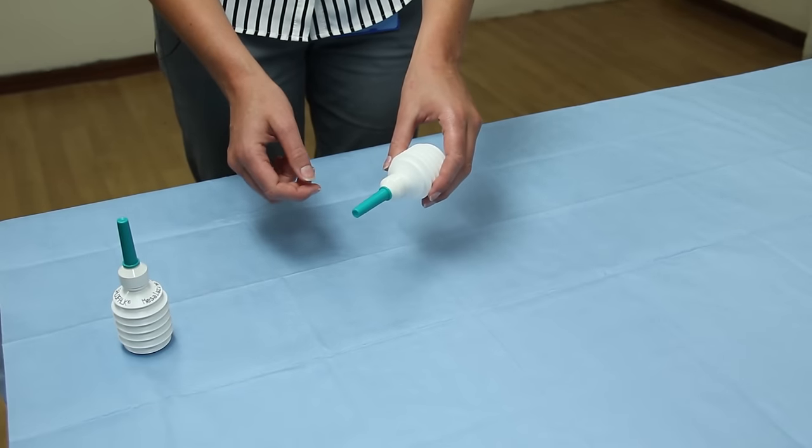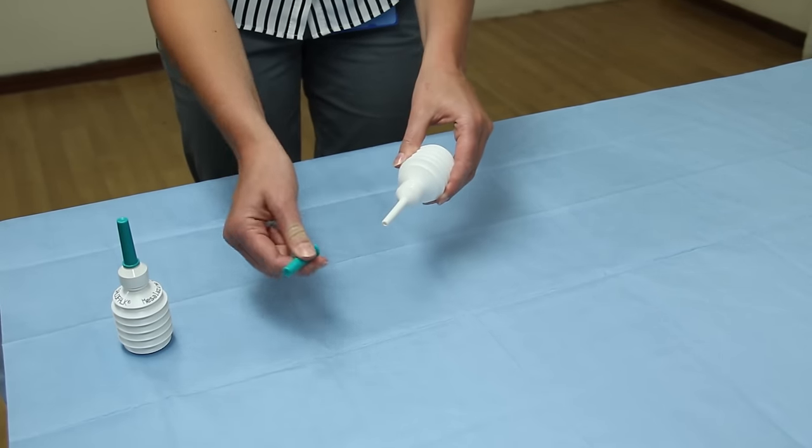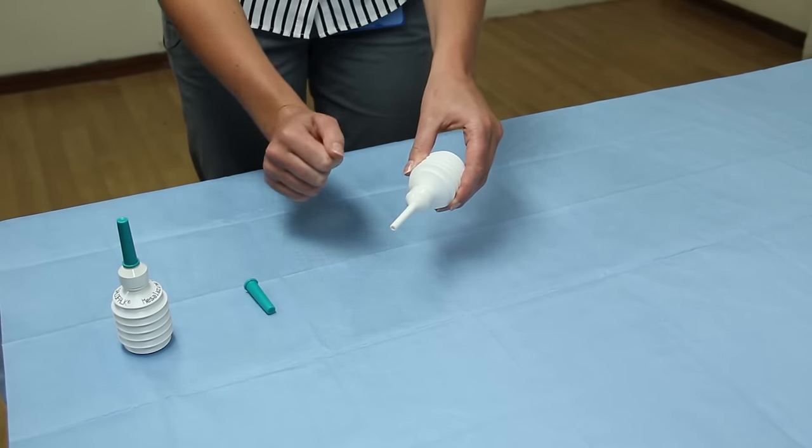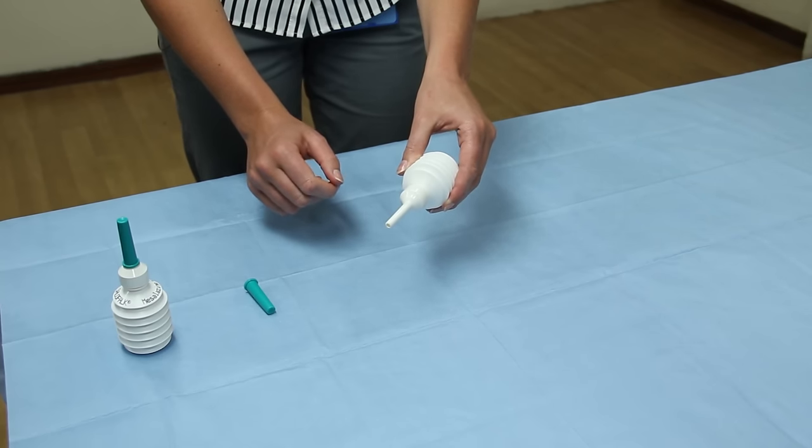So like with the foam enema, once the cap is removed, it's got a lubrication on the nozzle. So it makes it easier for insertion into the back passage.